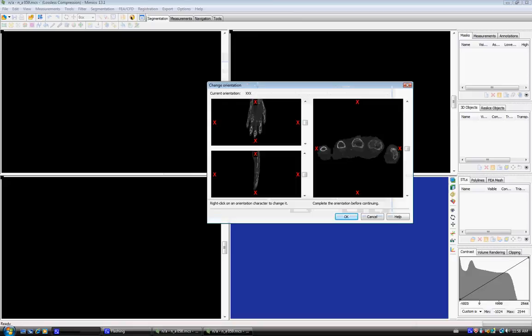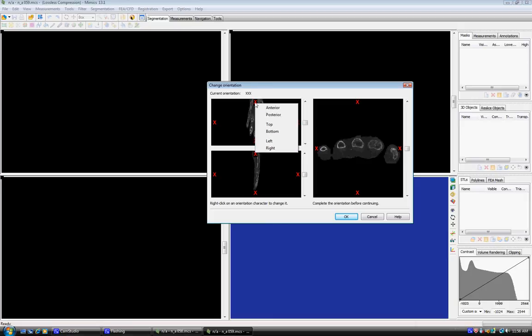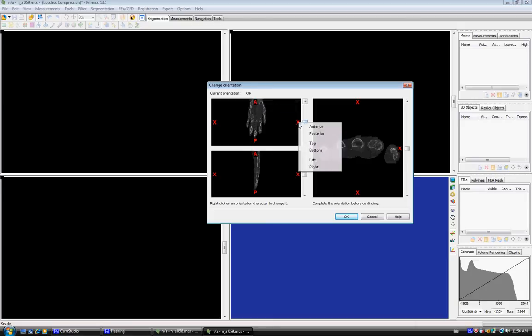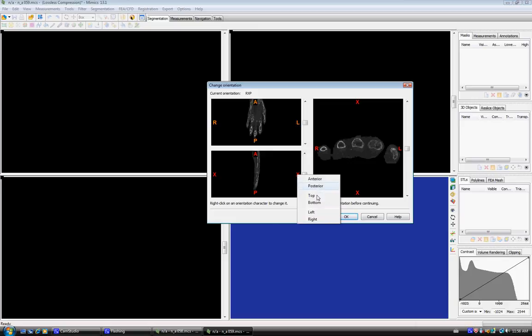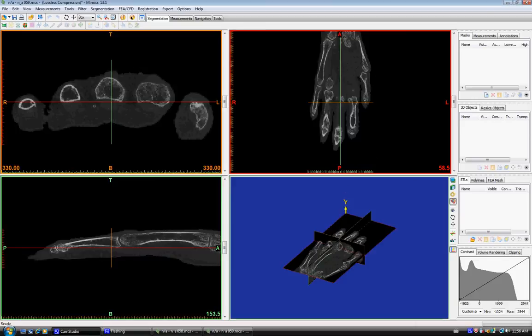Just before we put it into Mimics, we have to specify what directions the scans are in. This one is anterior, this is left, and this is top. Then click OK. And there we go, the images are in Mimics.